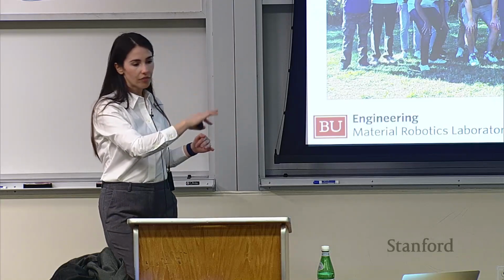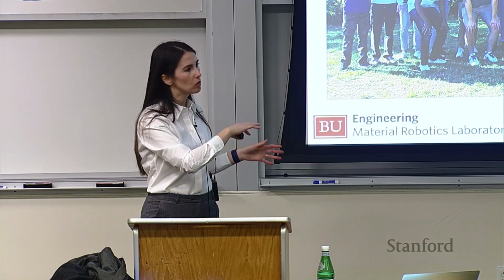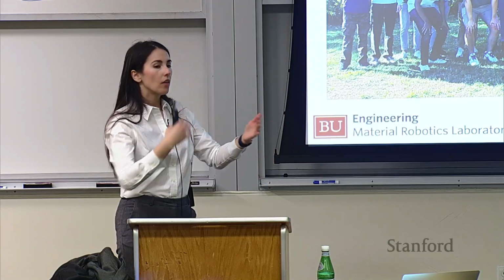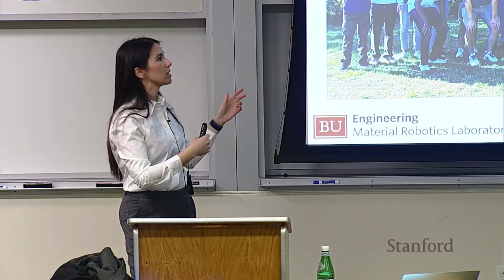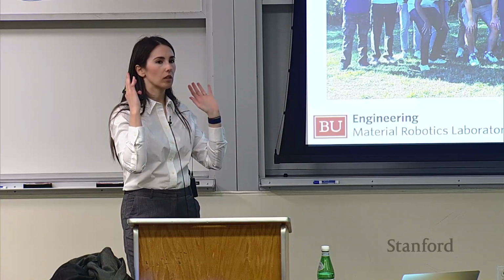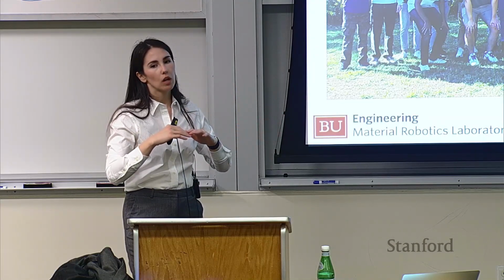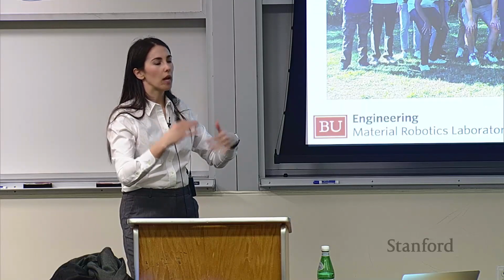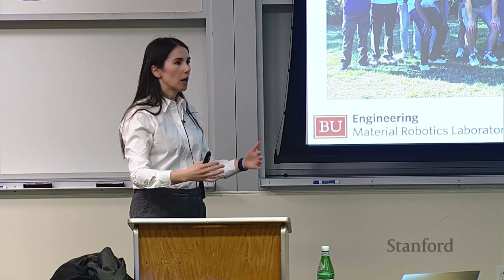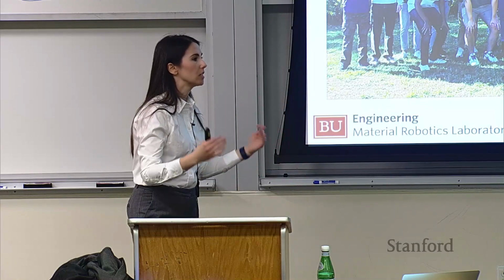But then again, definitely there is more work to do, and we're hoping to be validating these systems in vivo, like I mentioned, really soon on live animal models to evaluate safety concerns. On the other hand, one thing that I probably haven't stressed enough is that the robots I talked about today are all conceived with the idea of using them as disposable. So no need to sterilize them and have them undergo many procedures, and that gives us a little more room for safety because they will not be used for many cycles. And so hopefully the risk of an actuator failing is lowered by that.